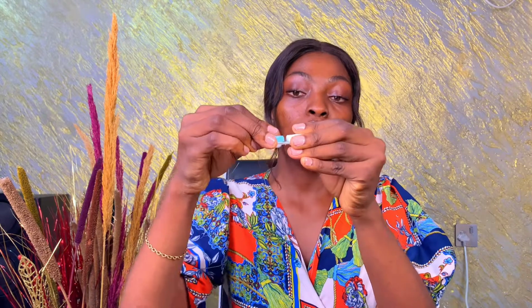Now for application, we have this eye drop here. Some people use it before applying the contact lens, but me, I like to use mine after applying my contact lens. How would you apply this now? I'll start with my right eye. So I'm going to open up now, still use the tweezers and take it out, and then I'm going to pick up the applicator, this one, and I'll put the lens on the applicator just like this, and then you want to apply now.